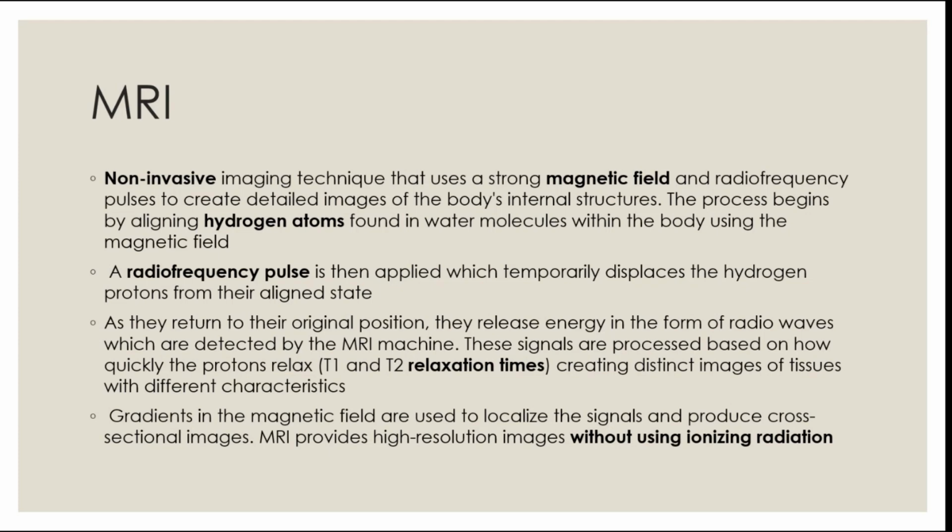These hydrogen atoms are naturally in a spin. The protons in the hydrogen atoms are spinning, so they create some kind of magnetic field. And when a strong external magnetic field, for example from the MRI machine, is applied, it causes the protons to align with the magnetic field of the MRI.